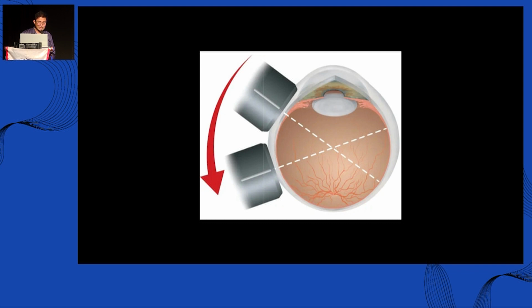Yeah, you have to do your own B-scans. Don't give it to someone else. In our days, you had to do a B-scan and you had to reconstruct the whole image by diagram. We were prohibited from taking printouts.